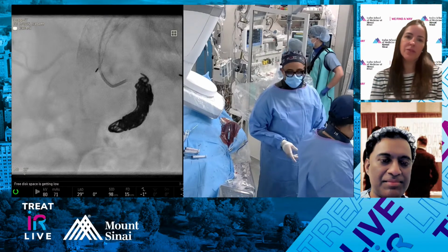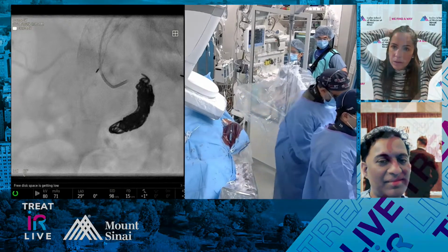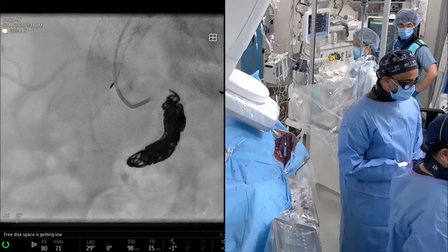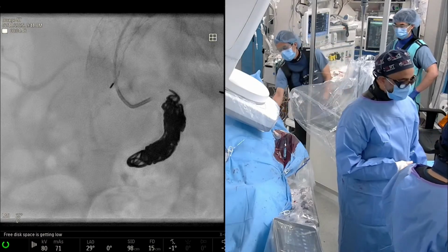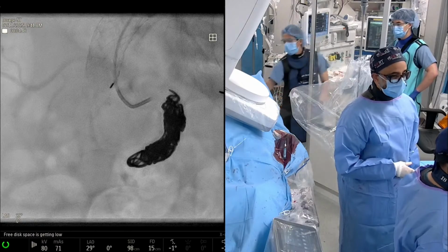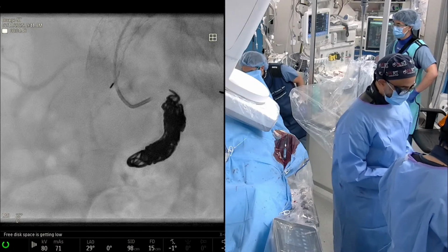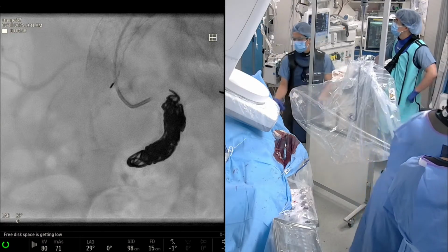Yeah, part of it also is that he's on Apixaban, he's on a blood thinner, right? So it's also making the coils a little bit harder to occlude. 150, yep. And it's interesting, it's that low dose of Apixaban, which is becoming more and more popular based on AMPLIFY-EXTEND. I think Abicat was reduction of VT events. So we're going to see more and more of this, even in the cancer population. Compelling data. I think we're going to see more and more with low dose protocol.